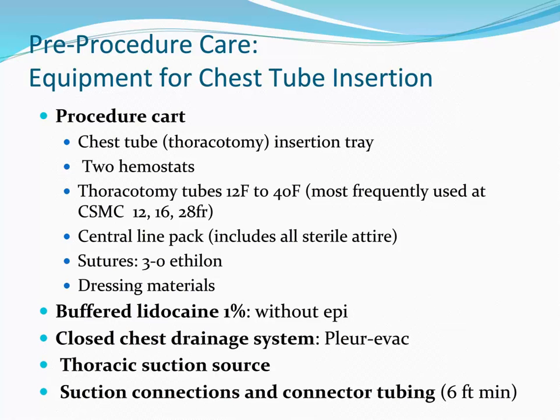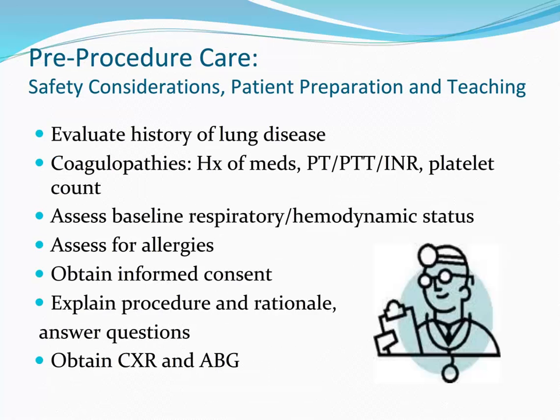Third, get lidocaine from the Pyxis. Now that you have everything you need to set up and support placement of the chest tube, someone should be on hand to support the surgeon during the procedure while the other is setting up the equipment. Whenever possible, consider sedating your patient. Make sure the consent is completed. In times of emergency, it is most important not to delay care. In times like this, one physician emergency consent is appropriate.